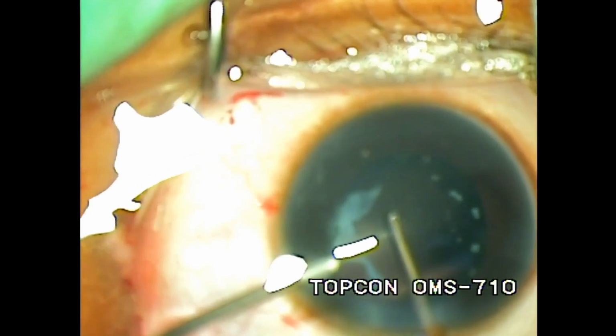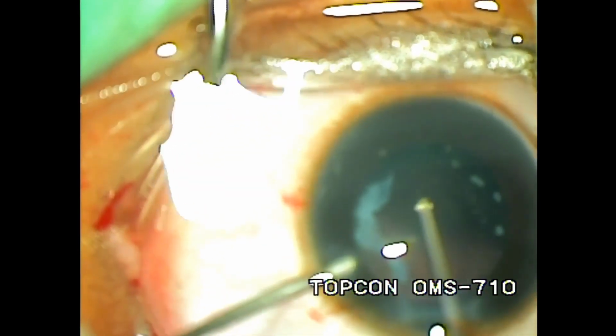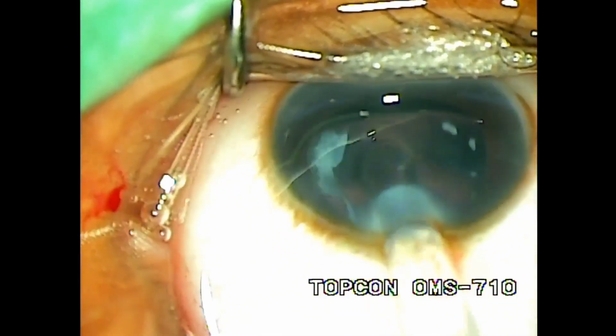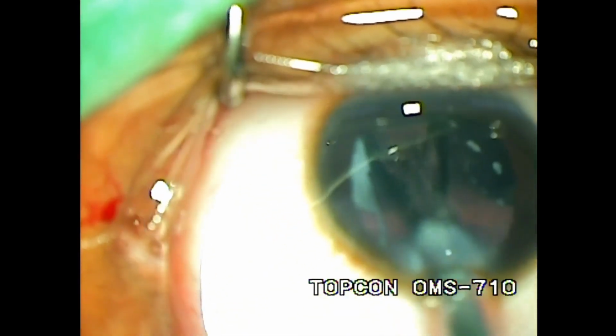Primary posterior capsulotomy is done as the child is less than 5 years, and anterior vitrectomy is done, followed by in-the-bag intraocular lens placement.